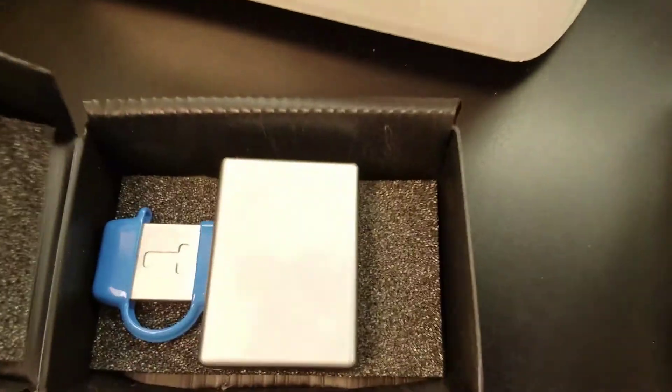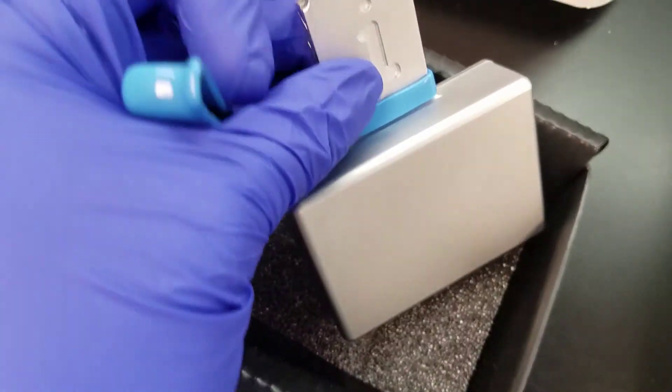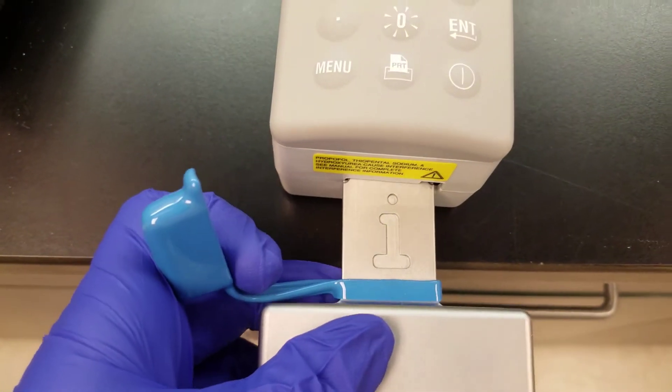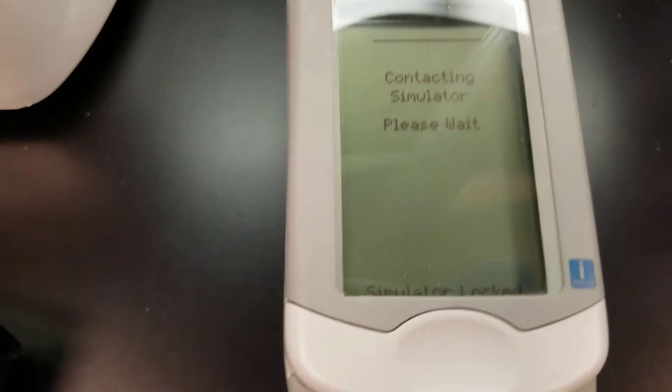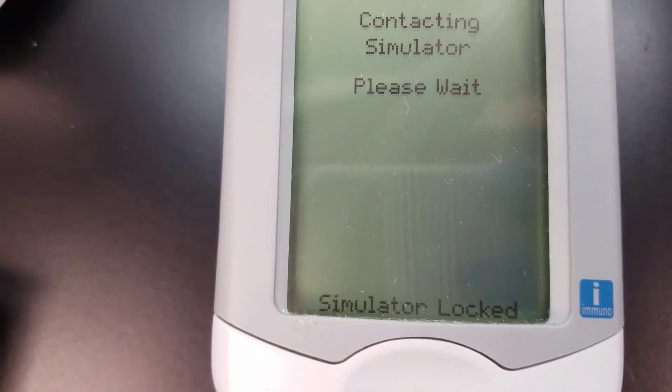This is what our box looks like — it has a picture of what the simulator actually looks like too. It has a little cap, and here's the chip that's on the end. We'll take that cap off and just insert the simulator in there. It says 'contacting simulator, please wait' and 'simulator is locked.'